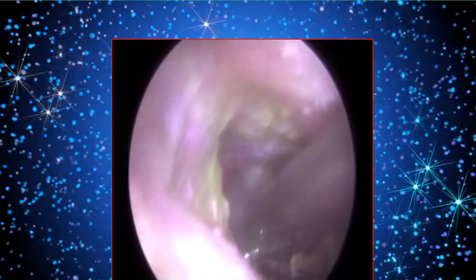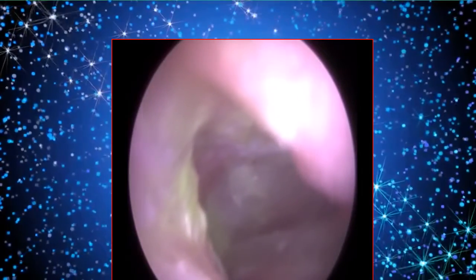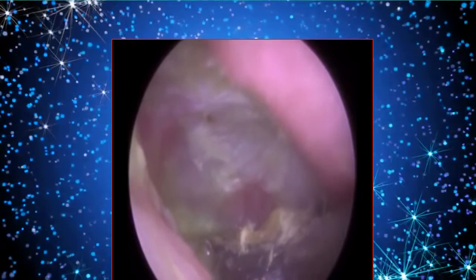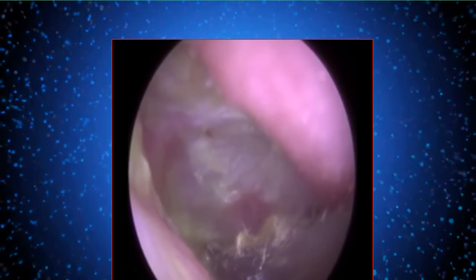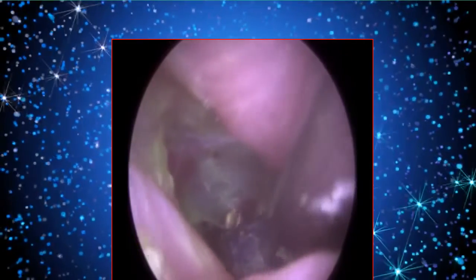There's the patient's eardrum, just so you can see the posterior quadrant, and you can see the eardrum's wobbling as well, because there's some debris on top of it. But the patient was really still, not experiencing any discomfort whatsoever, so that gave me confidence to continue. The ear is a lot better at this stage than it was right at the beginning, so you could hear it very well indeed, but I really wanted to get this out.